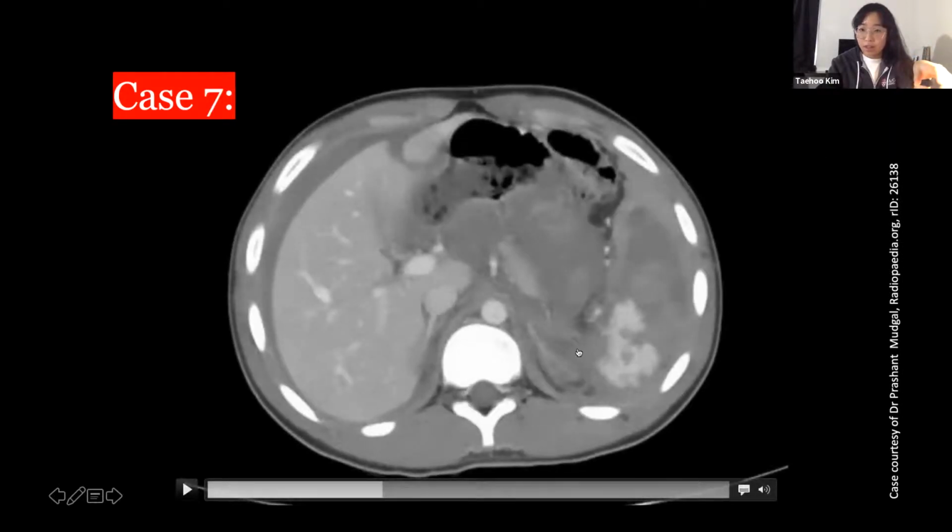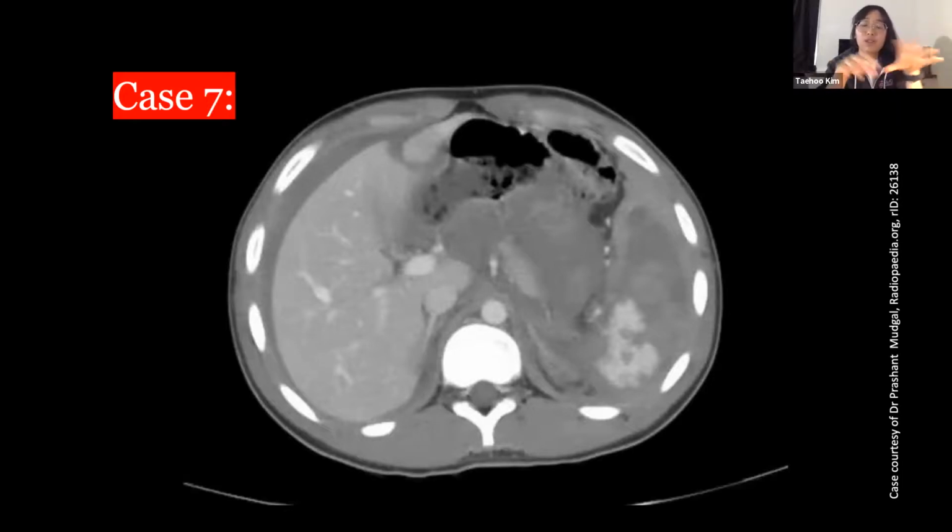And if you're lucky, sometimes they do CT without contrast. So you go back to CT to see if there's anything bright in that area. If there is, then it's not contrast extravasating, it's just calcification or suture material or anything. But if you have this pooling of contrast, and if you have delayed, which is taken 5 minutes or 10 minutes after the portovenous phase, and it's getting bigger and bigger, it means the blood is pooling there.